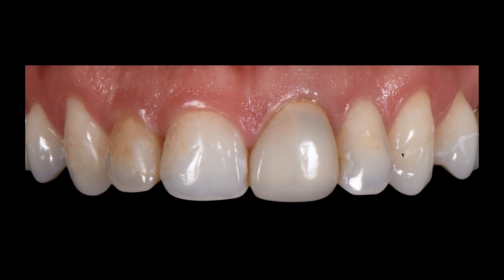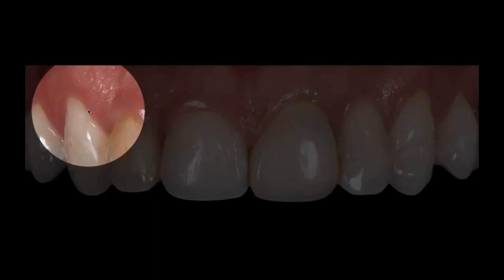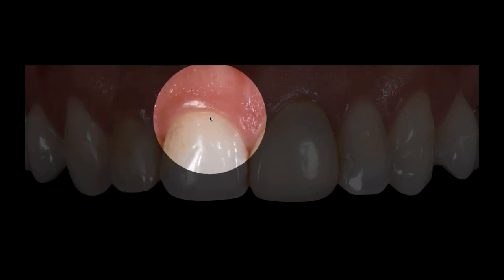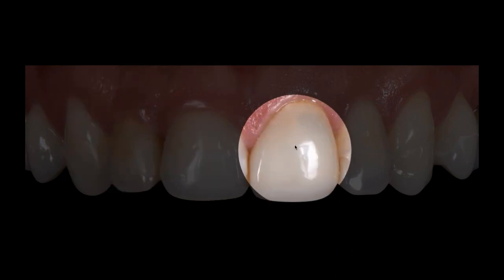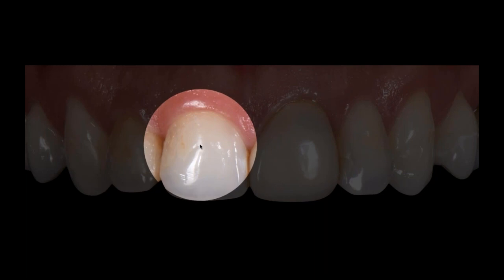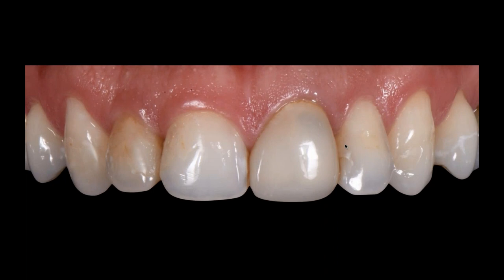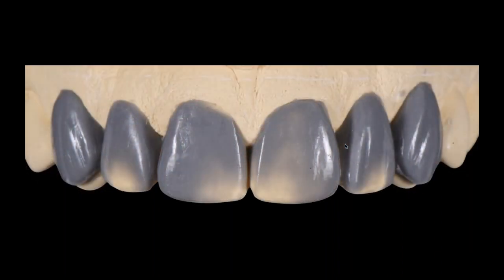Obviously, if you look at the teeth, you can see that the gingival architecture is short. So I'm going to want to do something aesthetically to manage the gingival architecture. That's going to be crown lengthening. He has a restoration in the number 9 area, and you can see there's kind of a black root coming through there. So you already know that there's a darkened root underneath there, and that's going to be problematic for you. Yet the 9, the 8, and the 10 were actually fairly healthy teeth, just had gingival issues that we had to work through to get the tissue in the right position. So in the end, we started doing a diagnostic wax up.